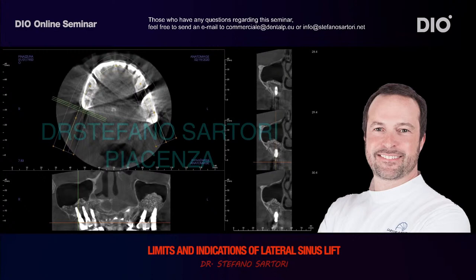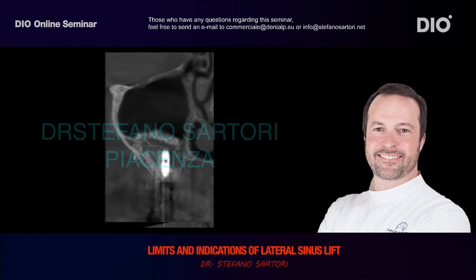In the literature, we don't know exactly what happens to the homologous block bone when it is positioned in the host. What we can see from these slides is a surrounding of the homologous bone by the host bone, especially in the next slide. Look, we can see the regeneration of a new cortical buccal bone over the homologous bone, and the surrounding of the homologous bone graft and the implants by newly formed bone. It's very interesting. And it seems that the newly formed buccal bone surrounds the monocortical homologous block bone.